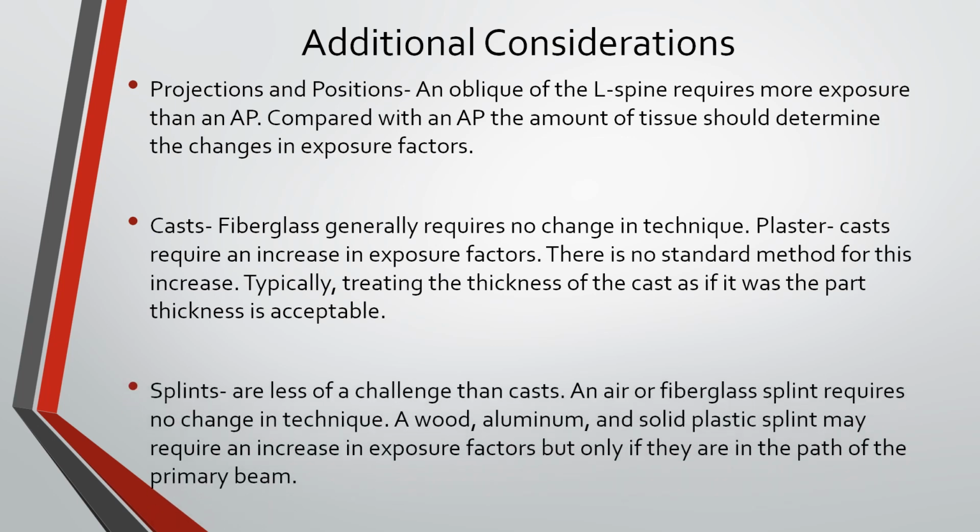Splints are less of a challenge than casts. An air or fiberglass splint requires no change in technique. A wood, aluminum, or solid plastic splint may require an increase in exposure factors, but only if they are in the path of the primary beam.